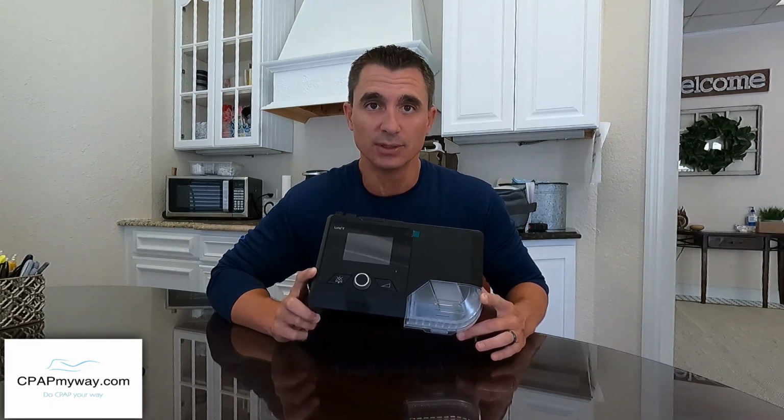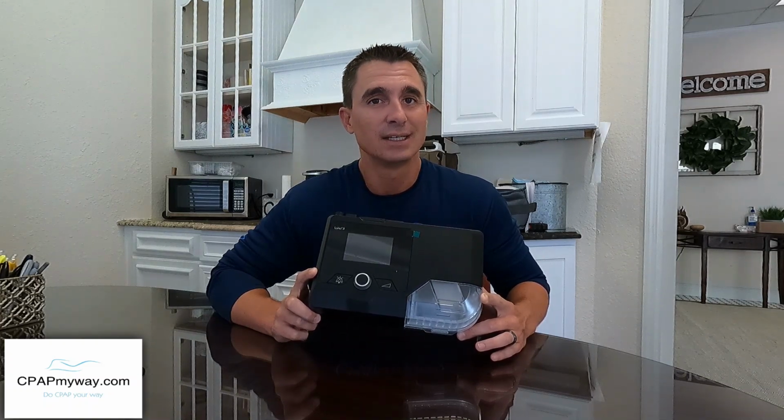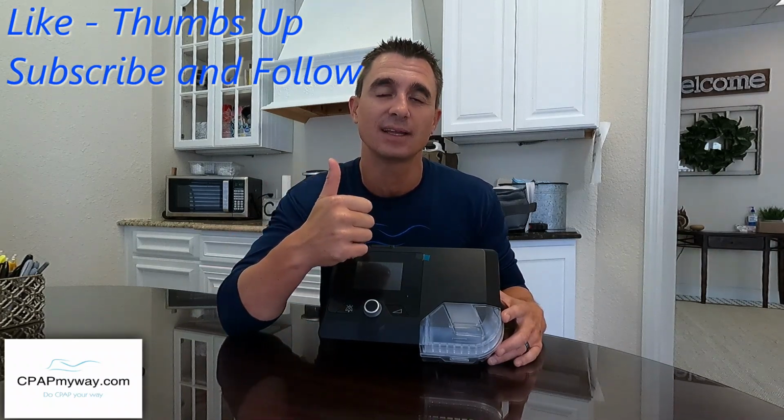It's really important to remember on these videos that if you don't know what you're doing in the settings menu, you're not a doctor or somebody that should be messing with these, or you haven't consulted your doctor, you probably shouldn't.